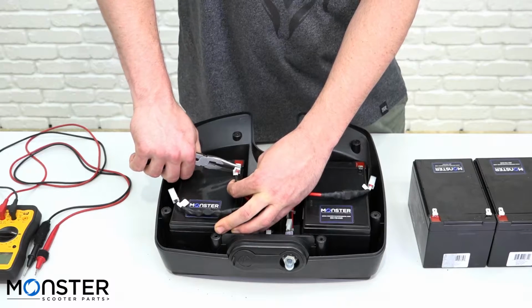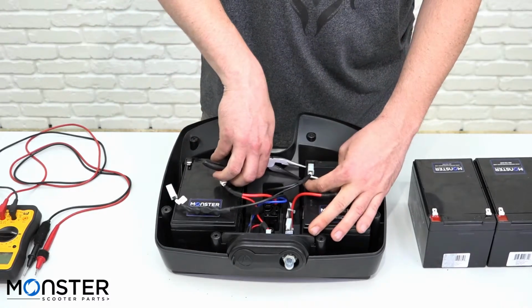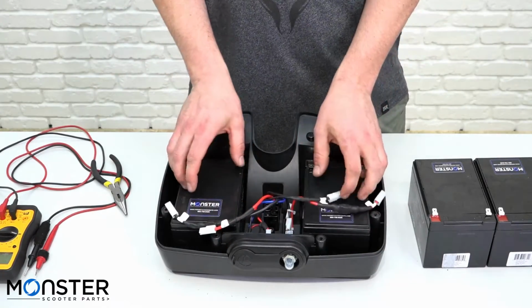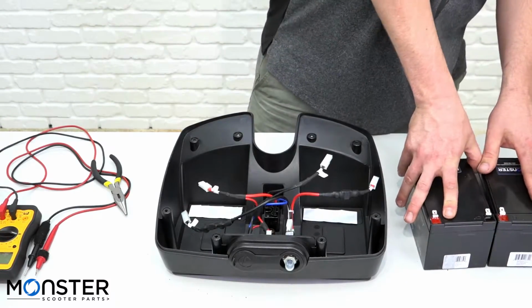And I am just pushing down on this white part to compress it to let it go. And then we'll finish off with the black inside wire. Just like that, your batteries are disconnected. You can go ahead and take them out. And we'll put our new batteries back in.